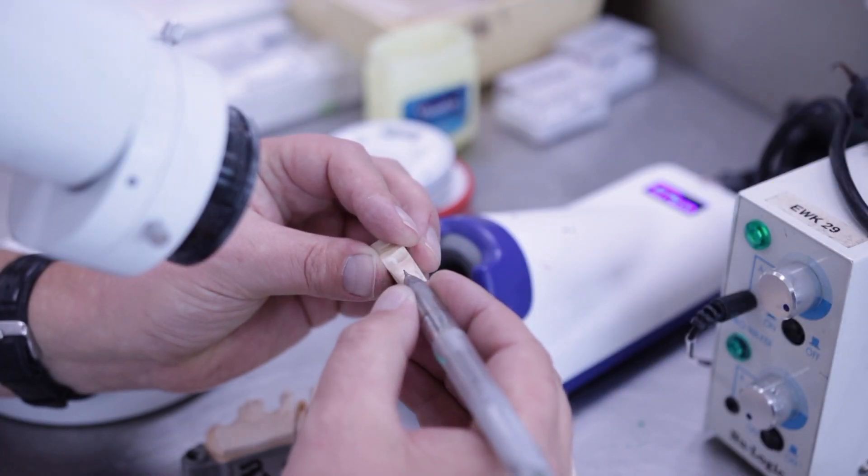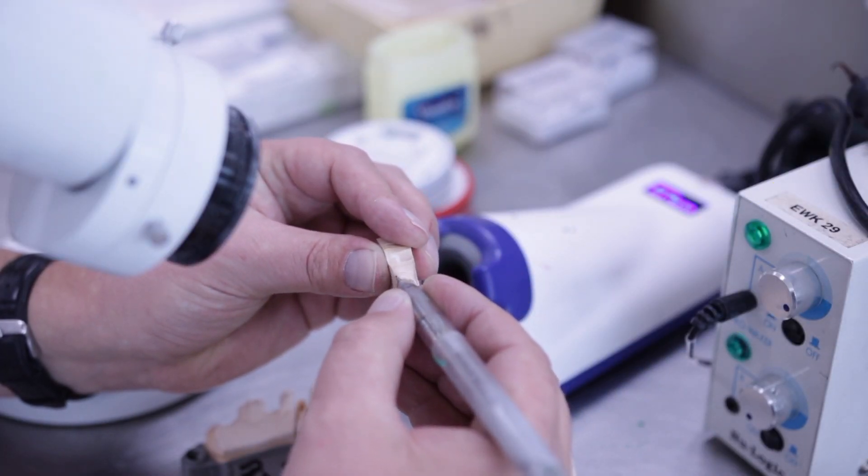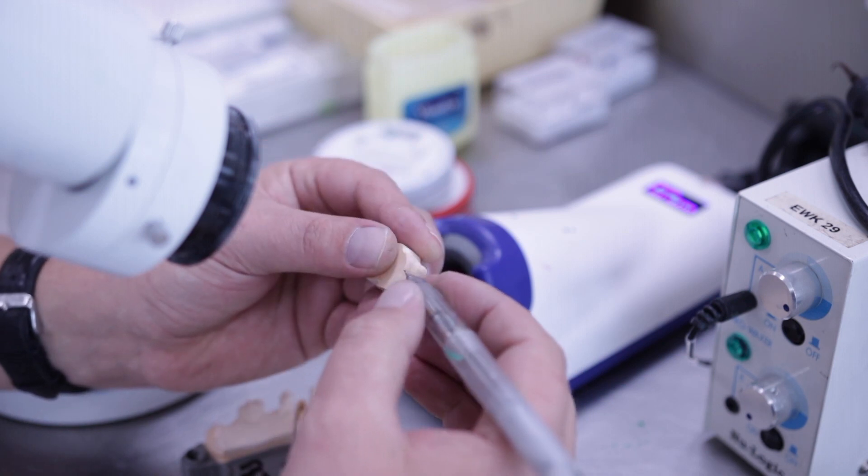Mark the cervical margins with a thin line using a pencil, preferably in the colour red or green.